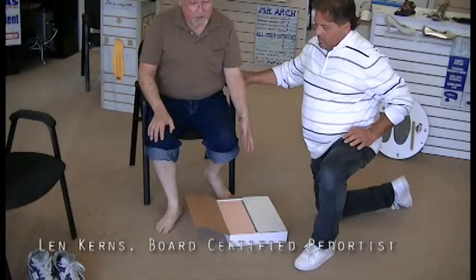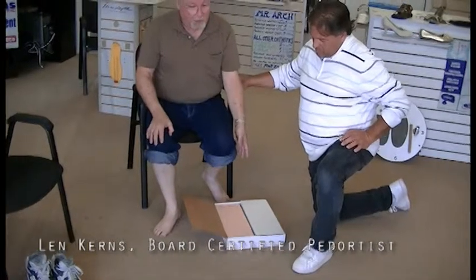And this method is based upon 3 years of me casting people with plaster. I was partners with a podiatrist, and all these angles are the same angles that a podiatrist would use, holding your foot in midair, turning the ankle in and out, setting your foot at 90 degrees, waiting for the plaster to dry, and then he puts it in a box, and we get just as many bad plaster casts coming in, if they take it bad, and just as many good ones. Same with foam. Foam is reliable if it's done correctly.